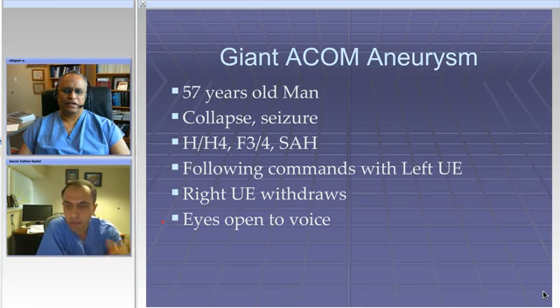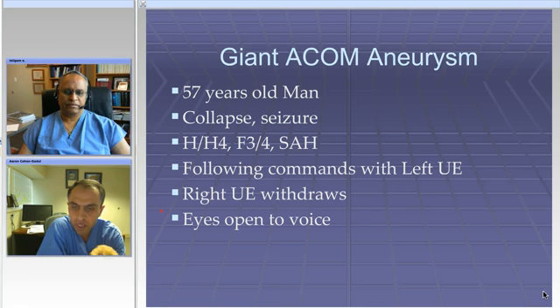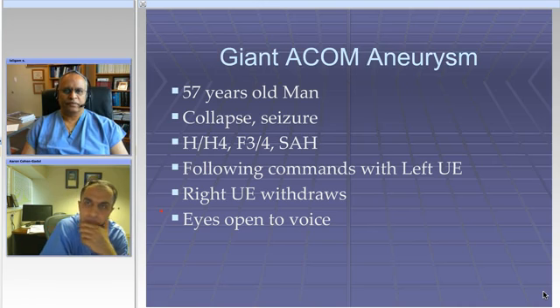Sheikh, I appreciate that. It's a great case. I saw that you put the clip essentially from the back of the aneurysm forward between the two A2s, rather than fenestrating the ipsilateral A2 with a straight clip. Can you discuss what the advantages between the two techniques are?